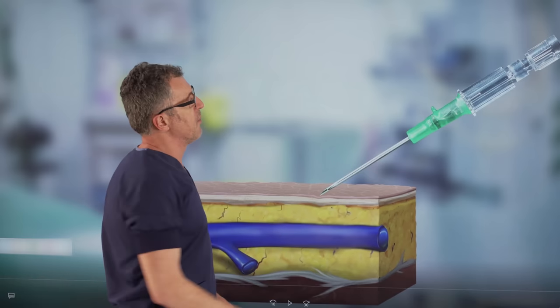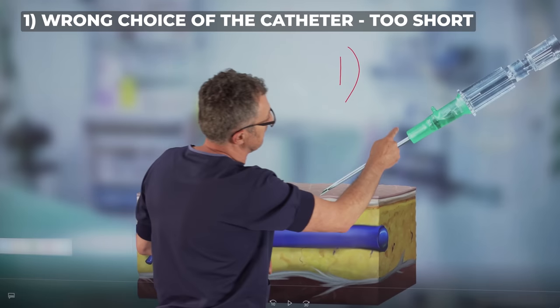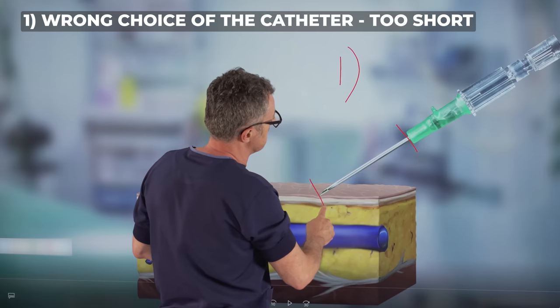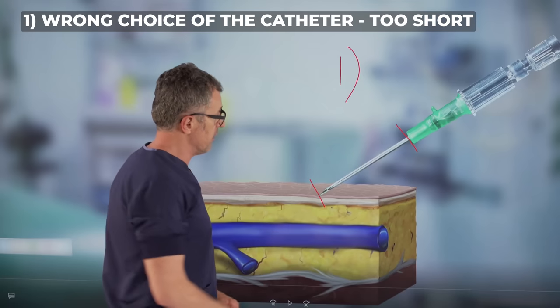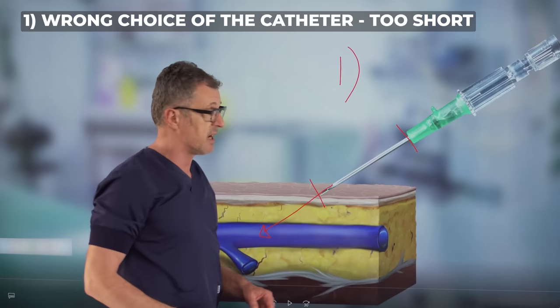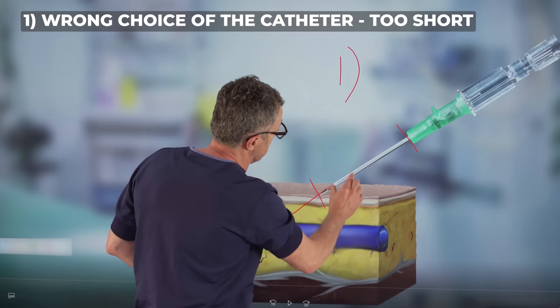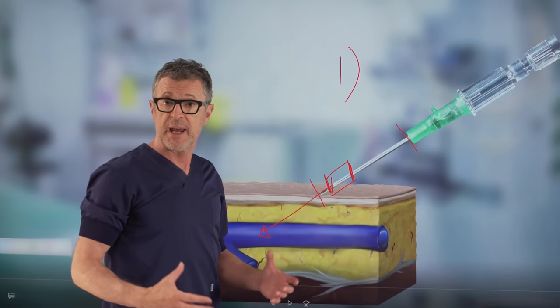Now notice how here we have this chamber and this chamber is where the blood will first appear. So we're using this chamber to monitor when the needle tip enters inside the vein. That would be an indication that it's time to lower the angle, advance the needle catheter system deeper and take the needle out to leave the catheter inside the vein. So here's mistake number one.